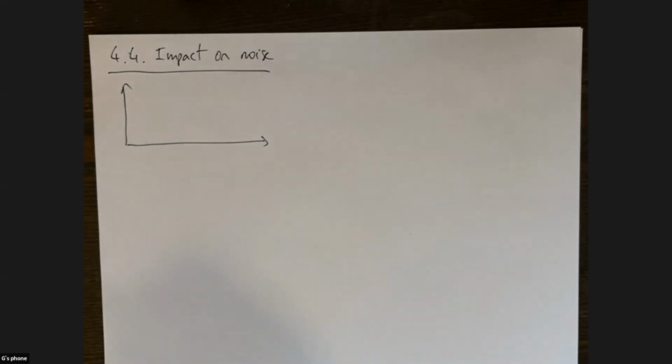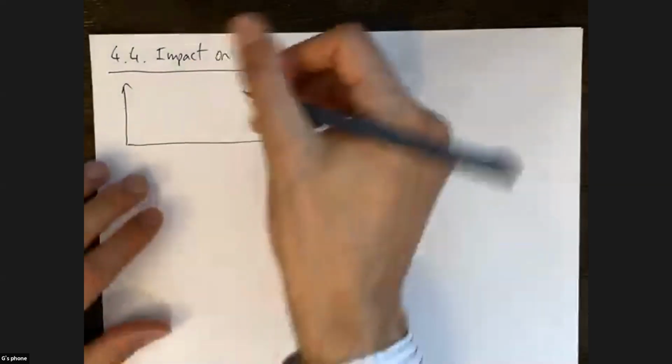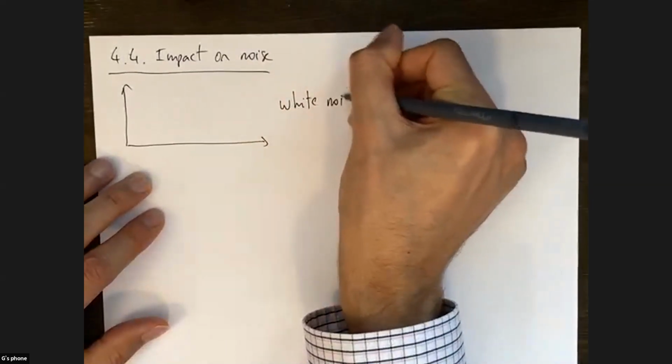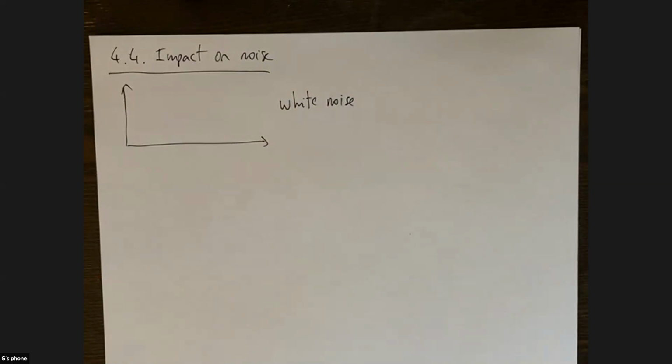That's because of either the electronics or the physics; there are different reasons. You could take a Fourier transform of an image of the noise and look at the frequency components of the noise. Most types of noise are so-called white noise, not white like the color white. This means there's no correlation between the noise in the different pixels of the image.